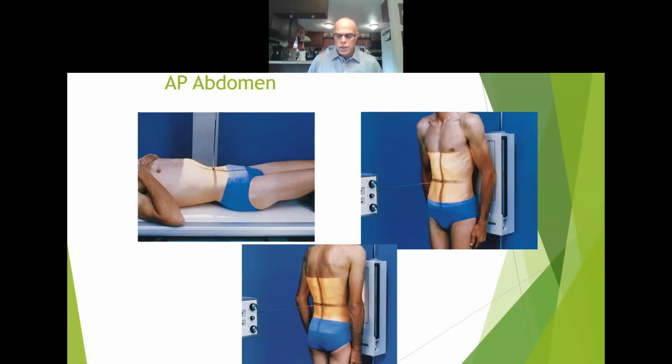For the supine position, center the IR collimated field at the level of the iliac crest. Again, remember I showed you there's a little soft spot right here, iliac crest, the inferior angle of the ribs. So you're going to put your hand right there, and it's going to cave in, and you're going to feel that curve right there. And in that indentation, you're at L4, or the ala, or the wing of the pelvis. That is L4. That is where your horizontal line will go. Your vertical line will always be MSP, MSP.